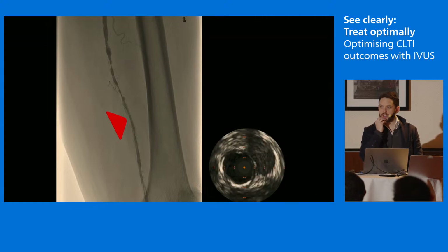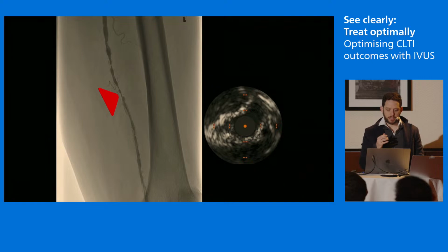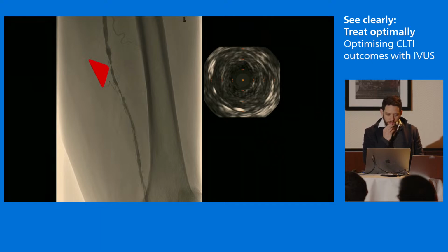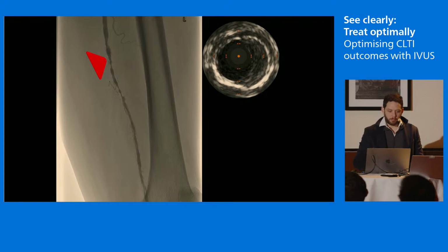It's just going to all be the same, either calcified or not calcified. Wait a minute. Oh, okay, fine. Wow. As an IVUS lover, this is like rare bird spotting for me.